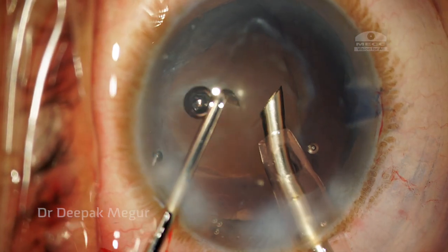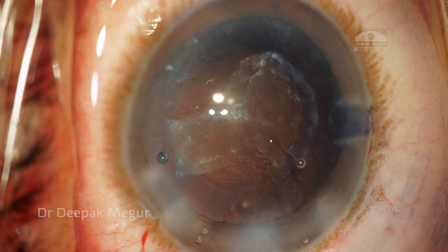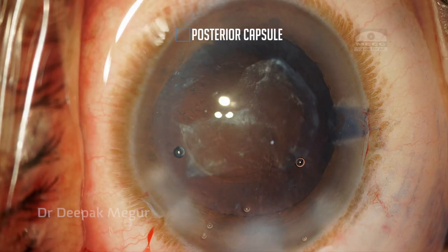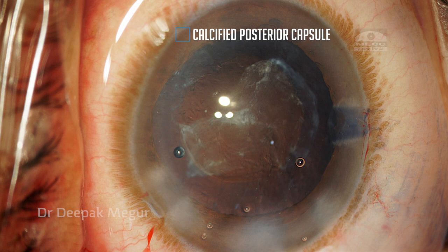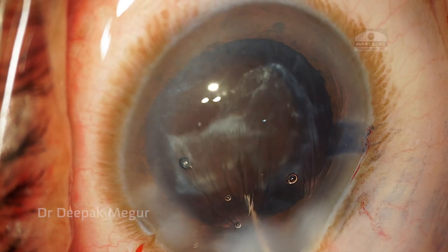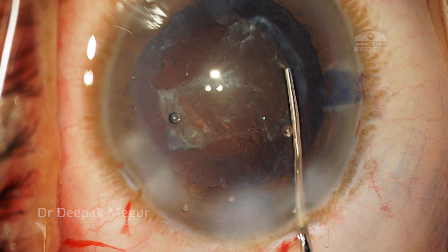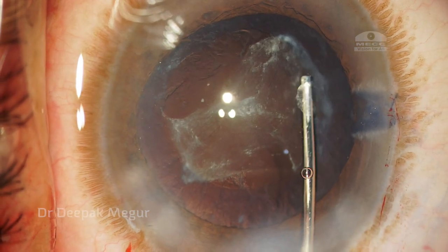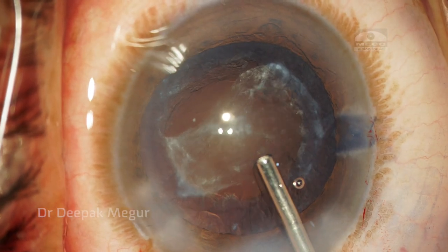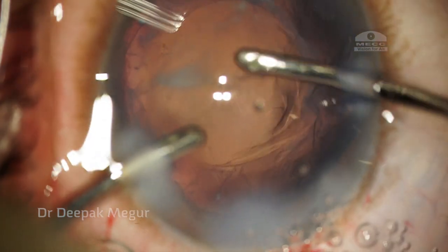Once that is done, we can see that the posterior capsule is thick and there is a calcified plaque — unfortunately it's in the visual axis. It doesn't look like the type where I could just polish it or scrape it off. It's quite thick and calcified, and unfortunately it's in the visual axis, and it is going to hamper the vision because of its location and density.